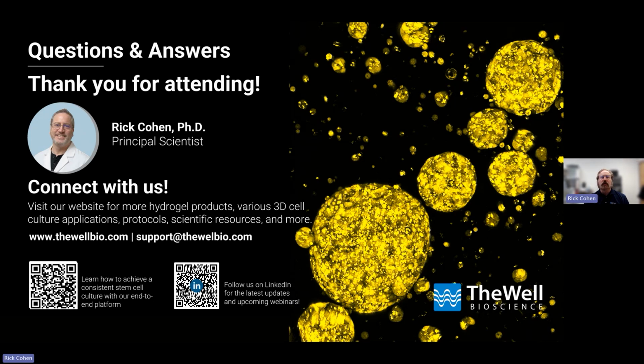That's a good question. So in the literature in 2D, we used to be able to passage cells from feeder layers using different techniques, cutting them up, and no one was really able to get single cells. And that was important for cloning, especially with mice. So then some discoveries on using ROCK inhibitor, either thiazovivin or Y27632, was fundamental in being able to plate iPS cells or embryonic stem cells as single cells and to be used in high throughput format.